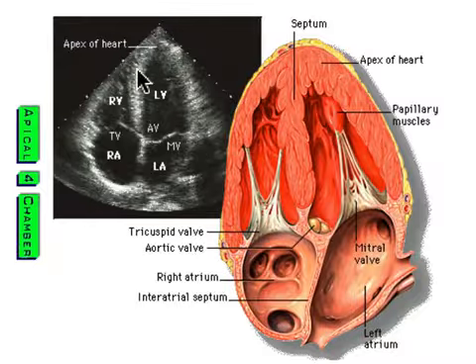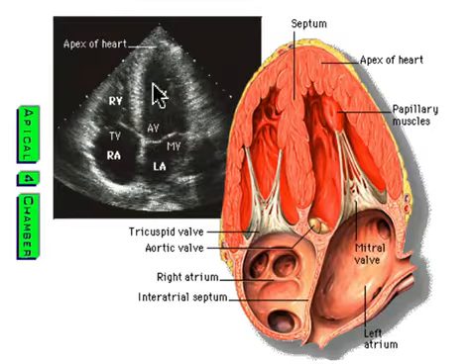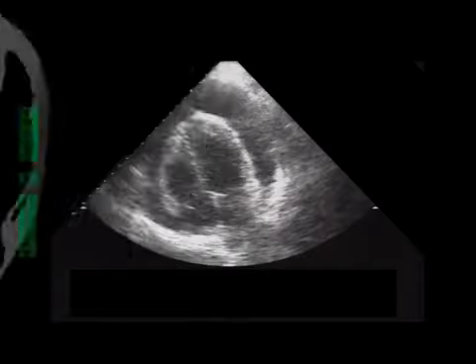The indicator's to the patient's right. We've got the septum of the heart right here. LV, the RV looking nicely 2/3 the size of that LV with the atria below it. This is a schematic view of what's going on in the LV and the RV and the atria with its valves seen there in that apical four chamber.